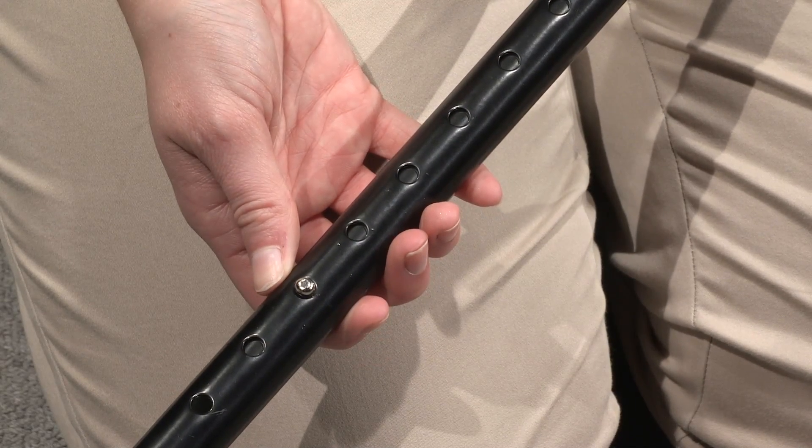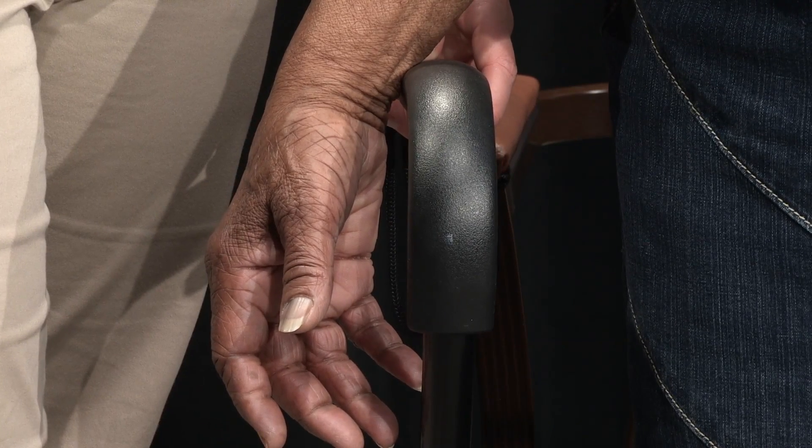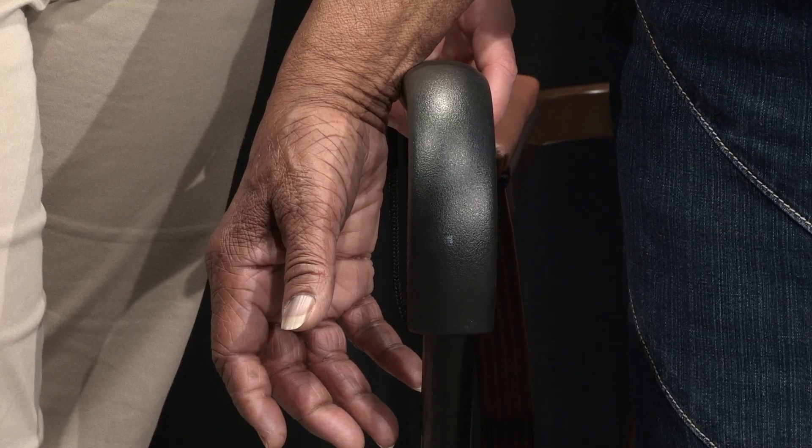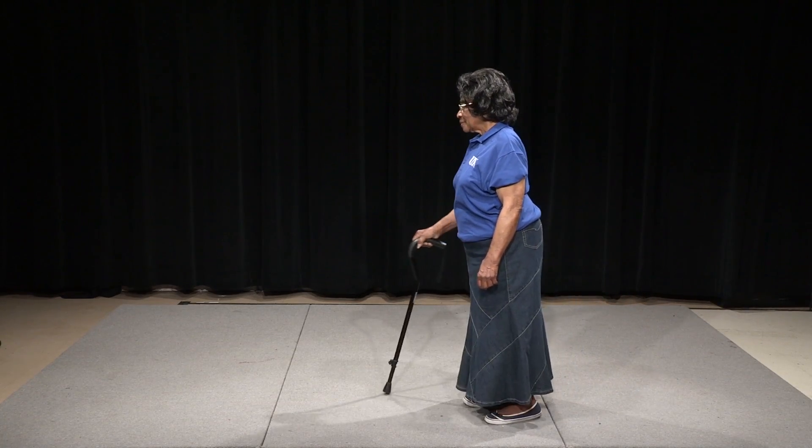After making the adjustments, recheck the height by standing in the original position and draping your hands over the hand grips. Once the cane is fitted properly, it is ready for use.